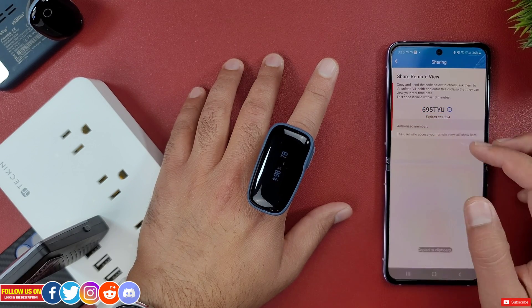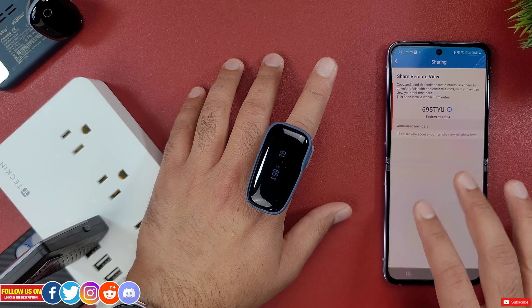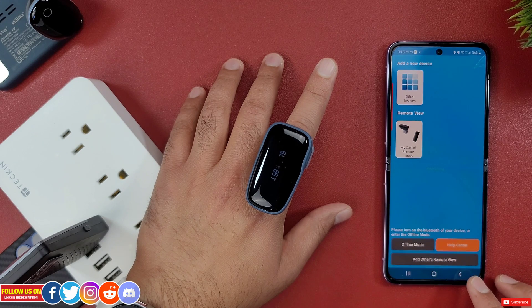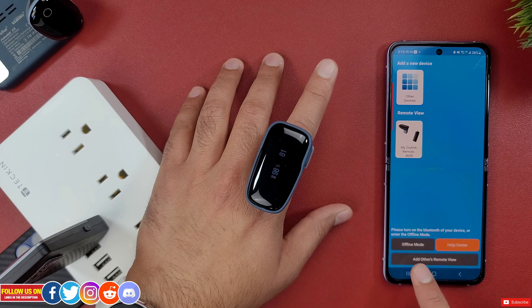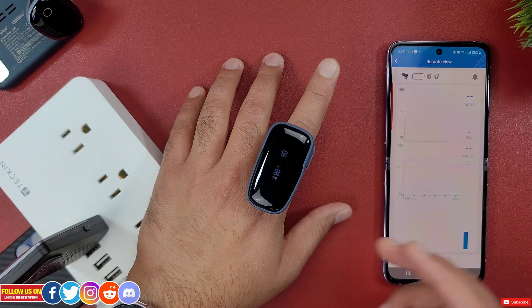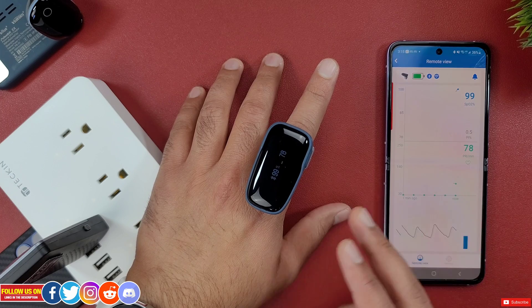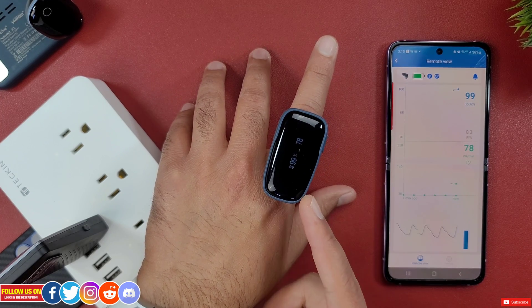Under Sharing you'll find a code that is valid for 10 minutes, which you can share with a family member. They just need to download the V Health app, enter this code on the home page under 'Add Others Remote View,' and they will instantly get real-time updates of vital signs as well as alerts. This is a very cool and robust feature, and from my testing it works great.